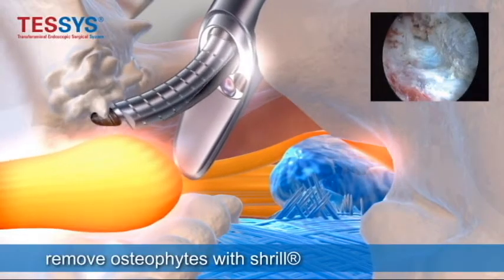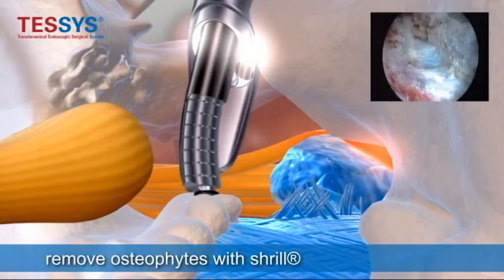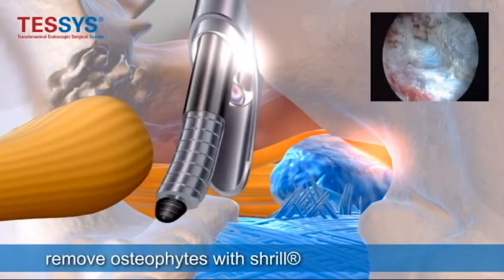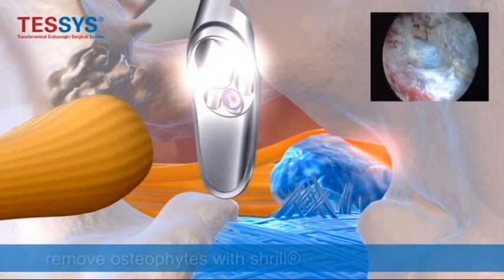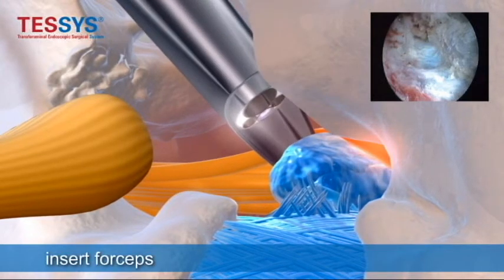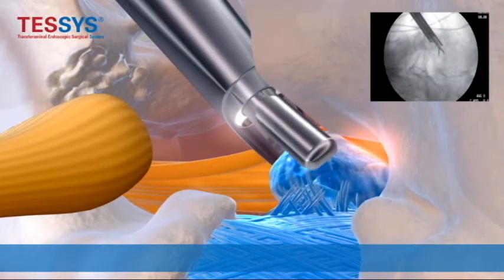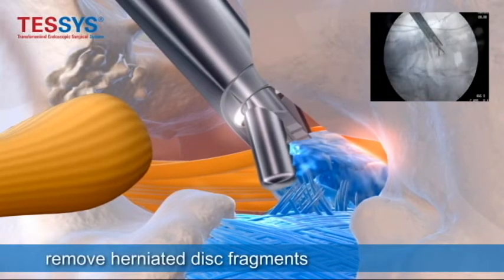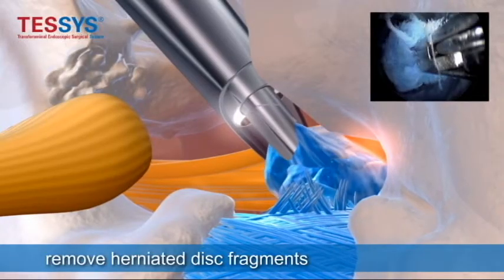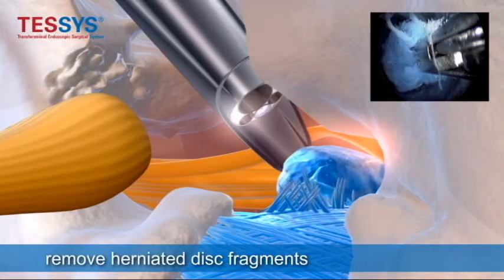You can take down the end plate and also more of the facet joint. Once you expose the herniation, you go in there with graspers or forceps under direct visualization and you pull out the herniation until you see the traversing nerve root, which is behind the herniation and is pushed up against the lamina, creating pain.